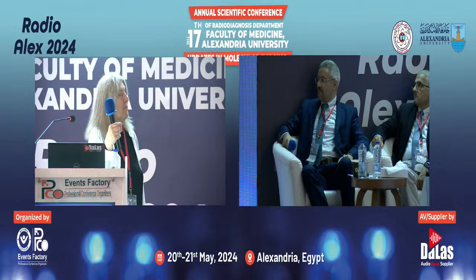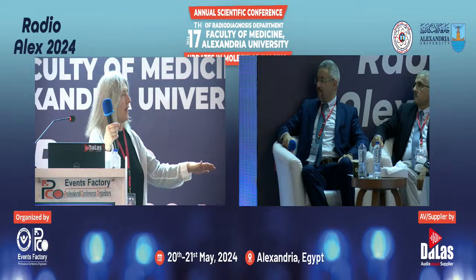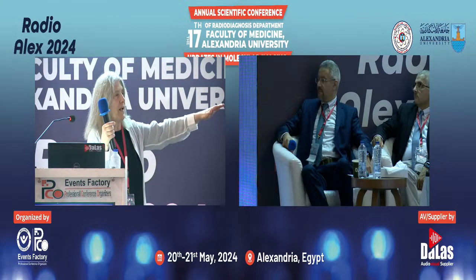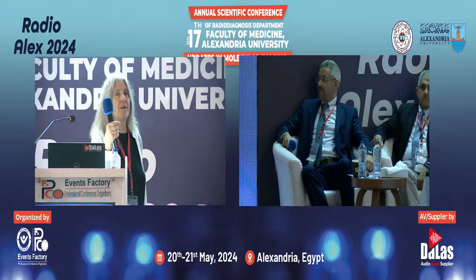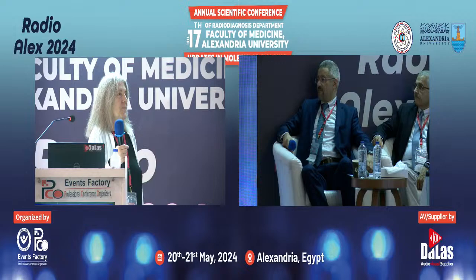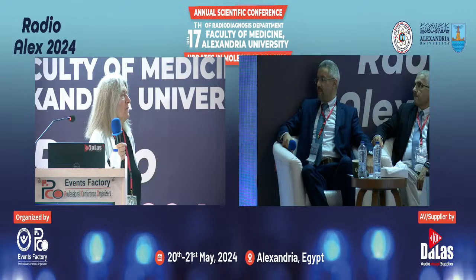So in reality, I don't know what the applications are. I have known many people that have both a PET MRI and a PET CT, and the PET MRI sits there and they don't use it. I don't know what to say about that. It certainly is a wonderful idea. The MRI that is performed with PET is usually not high quality; you don't do a lot of different sequences. It's a very simple T1 and T2.